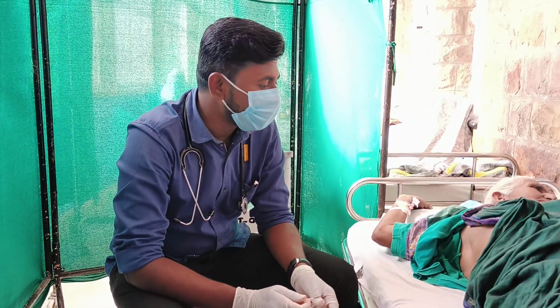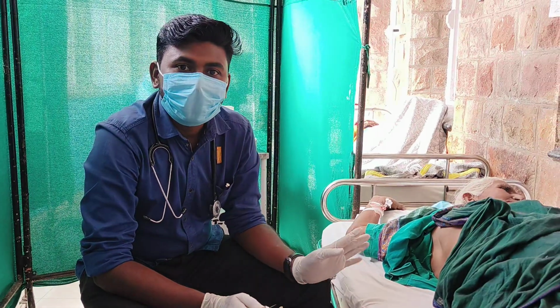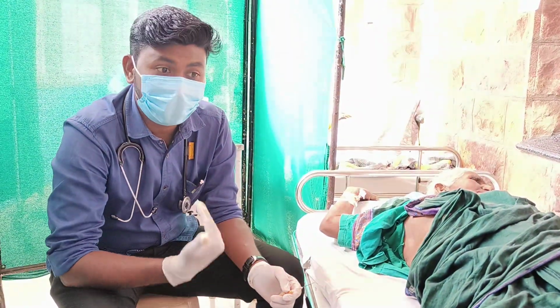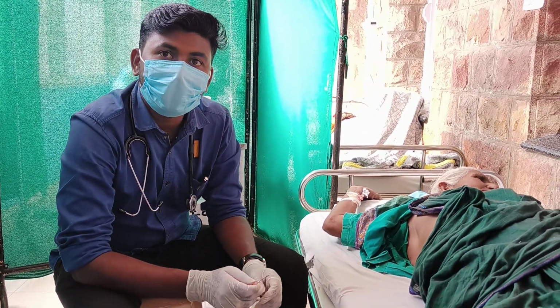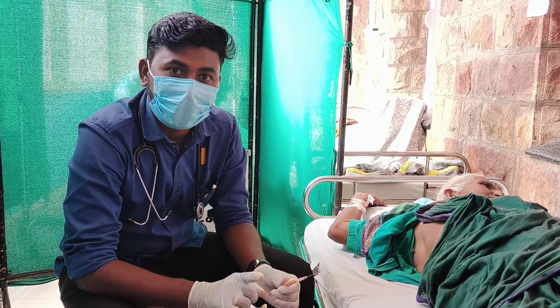This patient is not dyspneic or anything, because this patient had a massive pleural effusion. After the pleural effusion, we tapped it. After aspiration of the pleural effusion, she got some mild tension pneumothorax features. The X-ray shows a mild pneumothorax. So what we have to do is try to check whether this air is there or not.